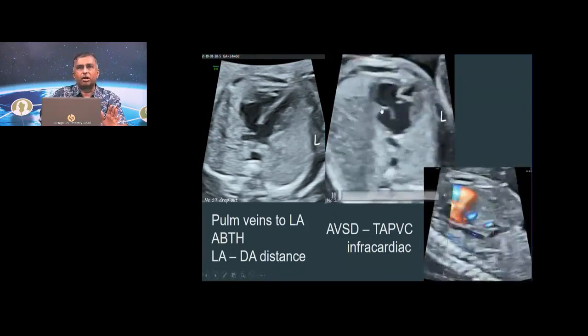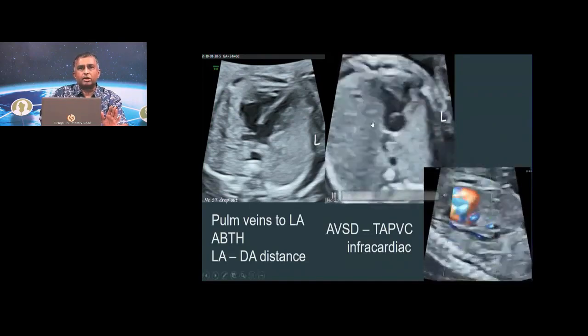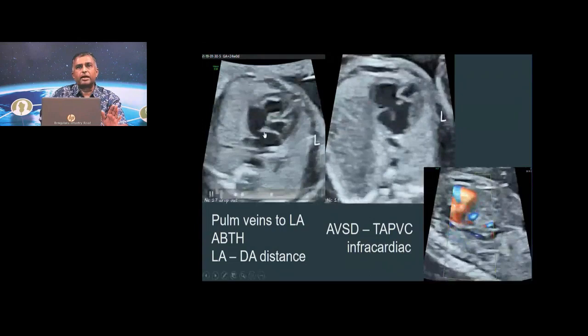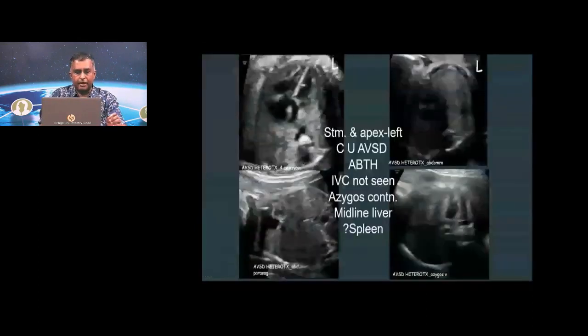Loss of offset, single orifice which is happening, ostium primum which is floating. An ostium primum should never float, it should be attached, and that's why we call it a drumstick. That's floating out there, and all signs of a complete AVSD that's happening there.